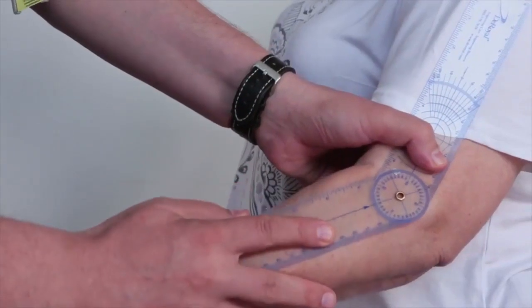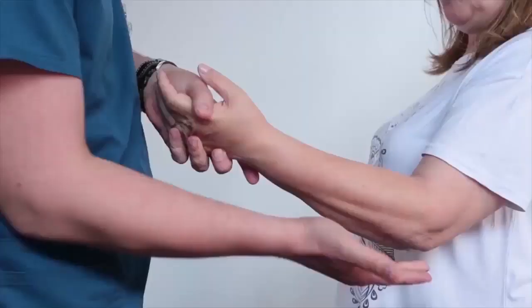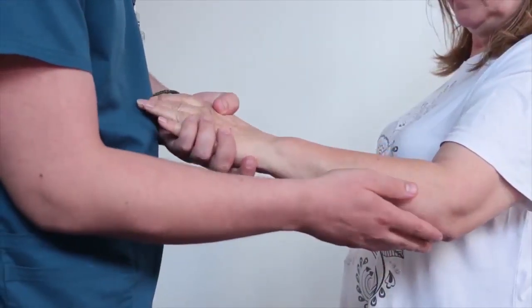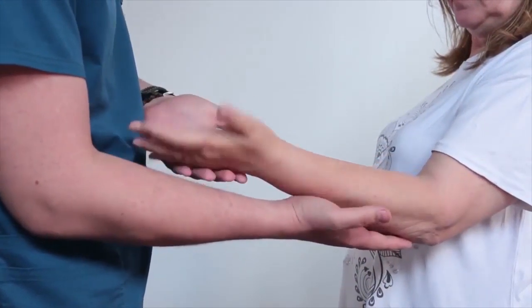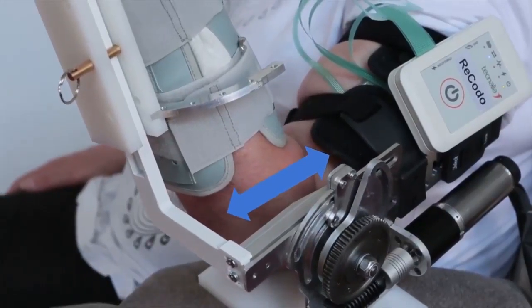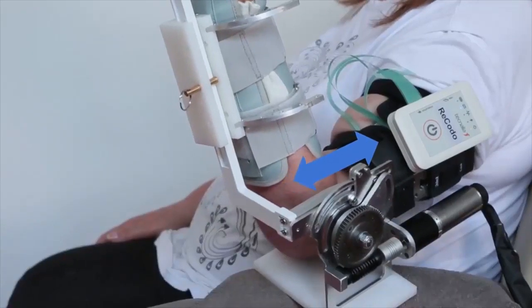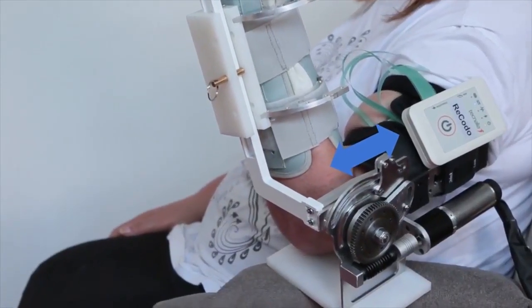In layman terms, a contracted elbow is locked by abnormal tissue structures that mechanically impede its movements. Humeral ulnar distraction maneuver helps unlock the elbow. This facilitates mobilization in a range of different exercises.